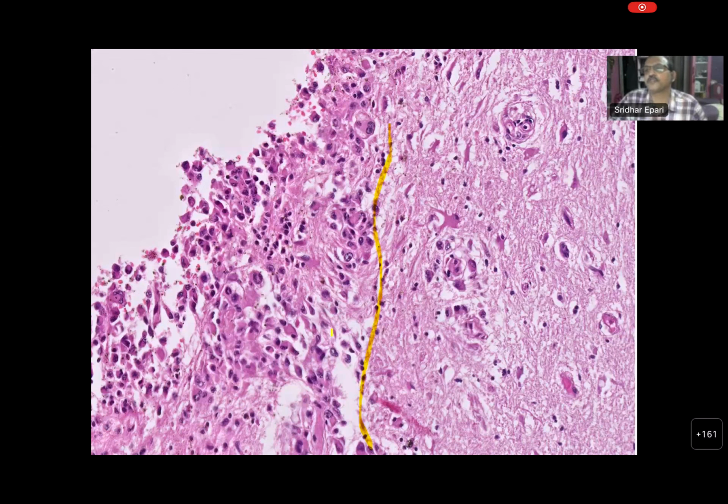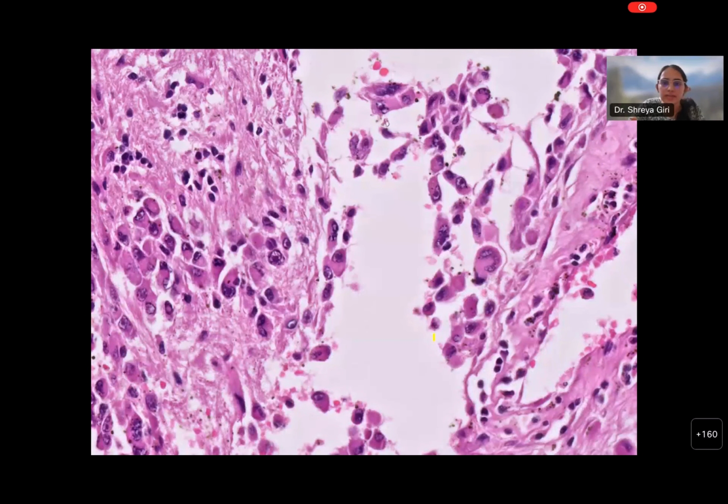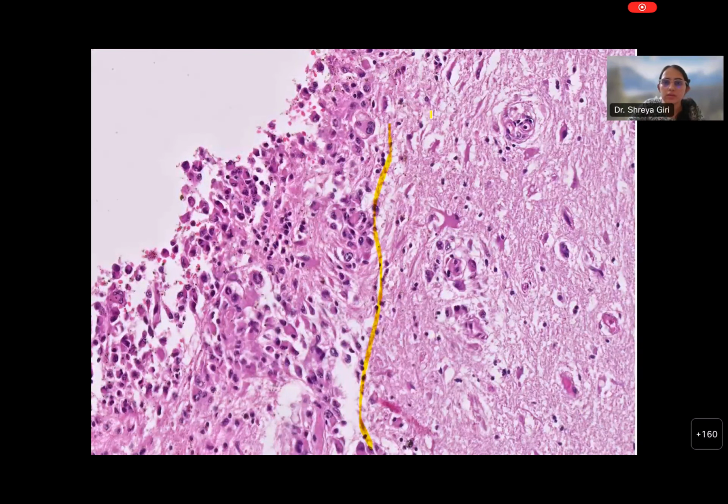Many of these high grade tumors can be circumscribed on histology and even radiologically also. Okay, Chair, you're asking something? I wanted to ask about the stroma on the right side. Is this the necrotic? No, this is normal parenchyma, native parenchyma.